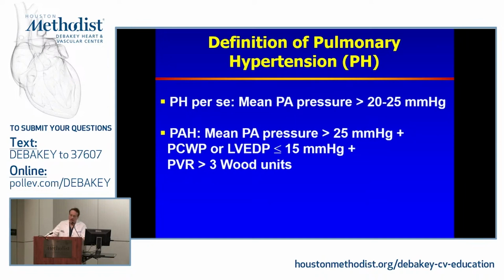As you know, the right ventricle is affected in pulmonary hypertension, and we get patients with pulmonary hypertension referred for an echocardiogram. What's the definition of pulmonary hypertension? It is defined by the mean PA pressure, not by the PA systolic pressure. At first, it was 25 millimeters mercury. The most recent WHO statement refers to 20 millimeters mercury as the upper limits of normal.